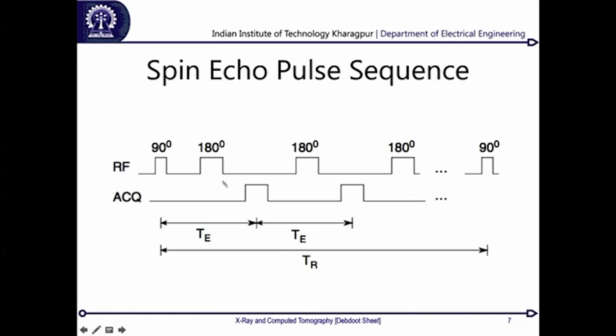Now, as we keep on doing it, we will see that initially there is an excitation time in which I first have a few of my protons in a high energy state and a lot of them in a lower energy state. After giving the first excitation, I basically turn all of my low energy states into a neutral state. Next, I give some more energy such that all of them bend down and go to a high energy state, and then I leave it.